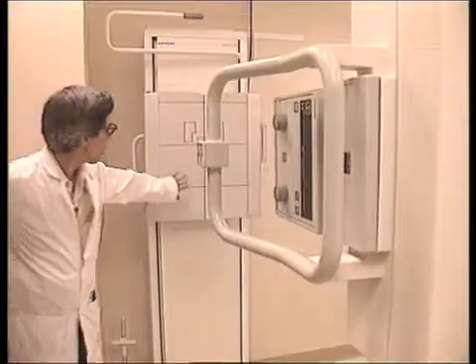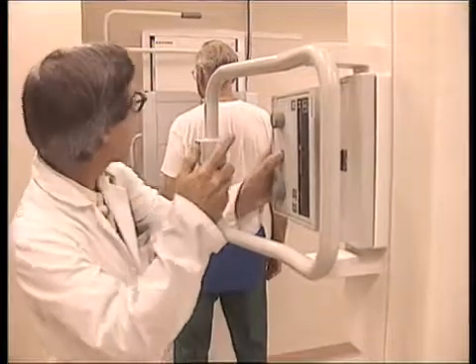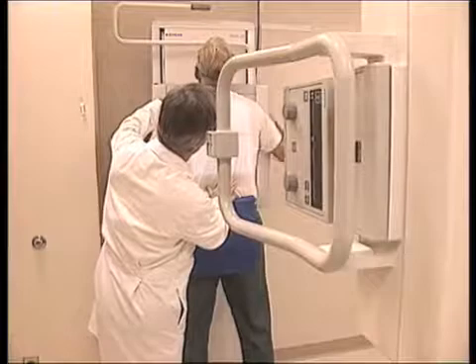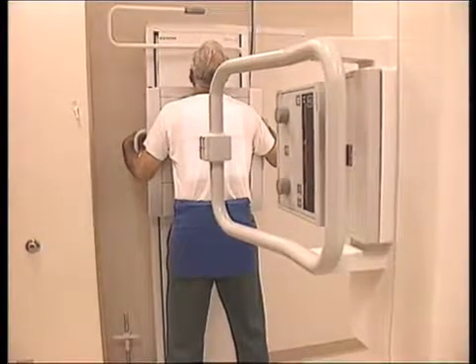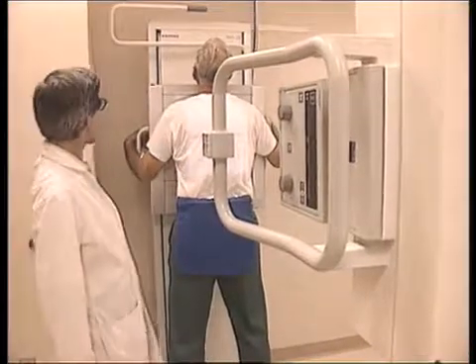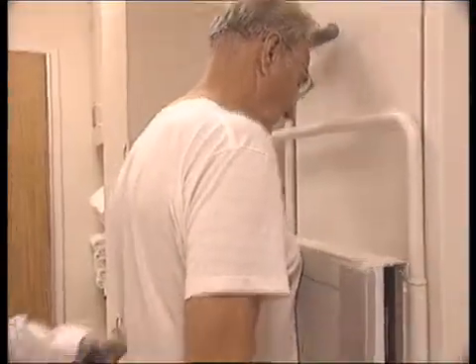Let's go over here please, facing this plate. I'm going to give you an apron for protection. Brush lightly against the board. Hold real still, don't move. Mr. Trachy, taking a deep breath — hold your breath. You can breathe, relax. We're all finished, sir. Step right over here please, sir.